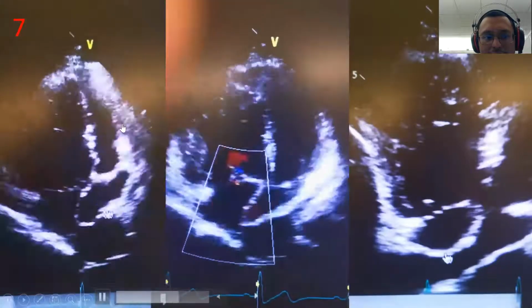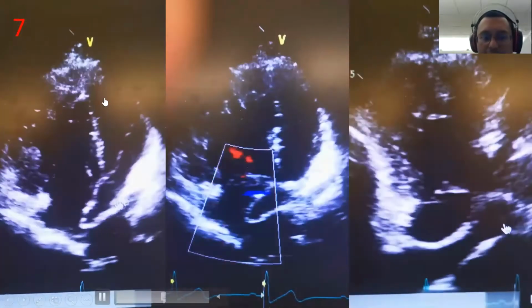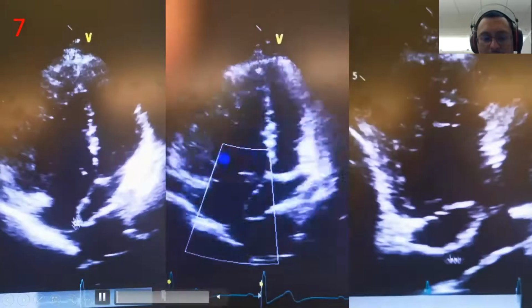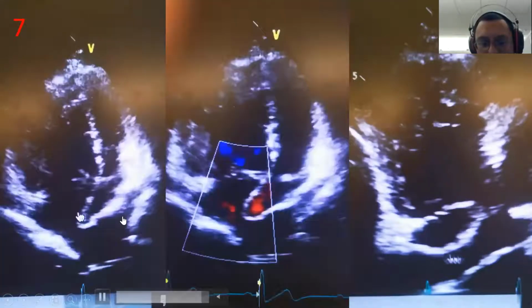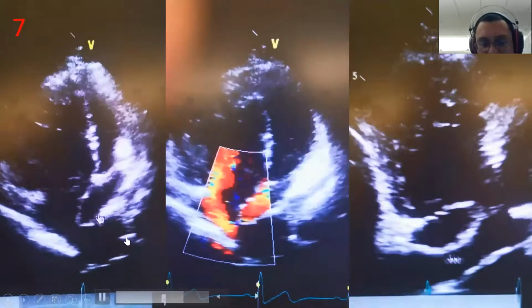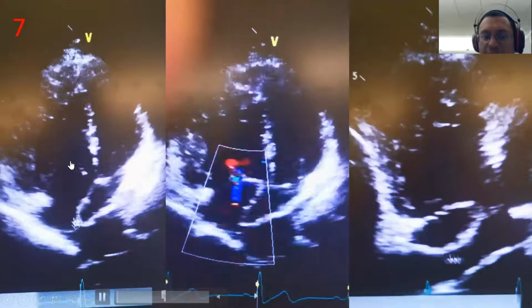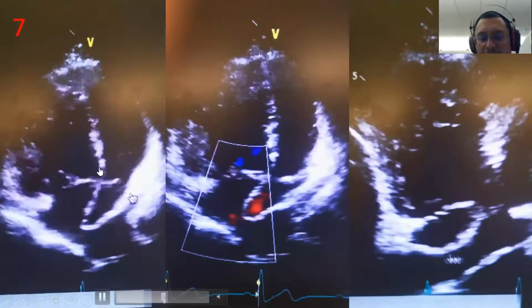So here, this is left ventricle. This is right ventricle. Okay, so the left ventricle is connected to the pulmonary artery. Right ventricle is connected to the aorta. So what happened in this patient is they baffle the blood. So you can see this one, the posterior part is the baffle. So there is a baffle of blood from the superior and inferior vena cava into the left ventricle, so that it can be oxygenated via the pulmonary artery.